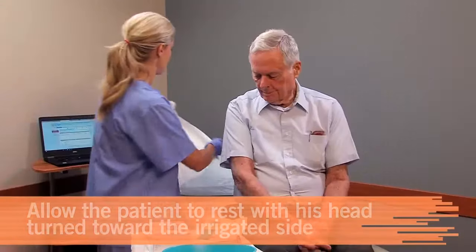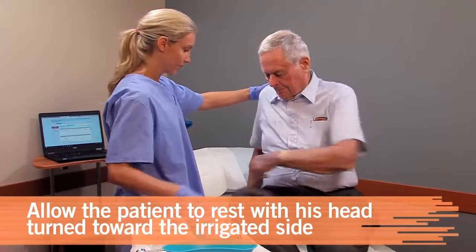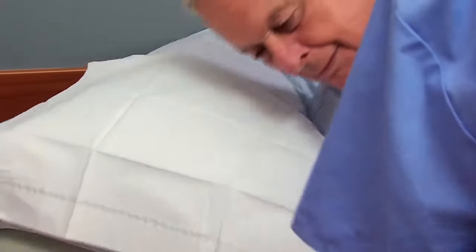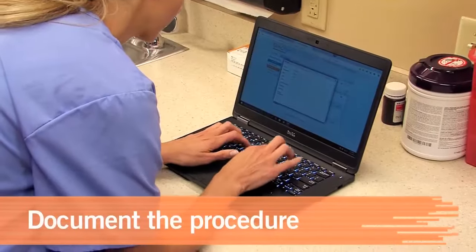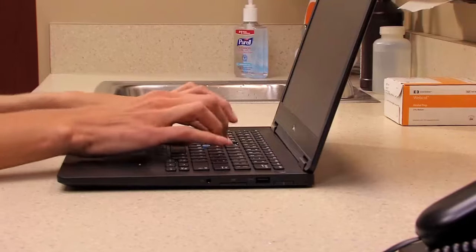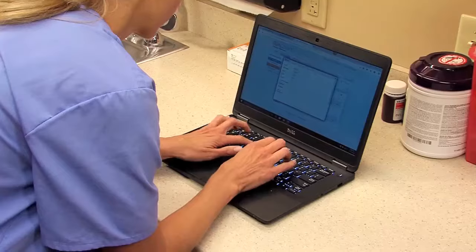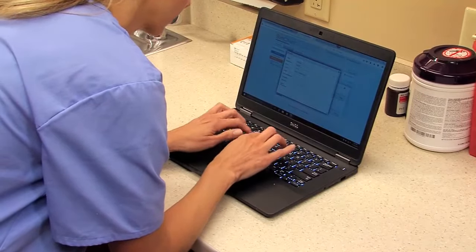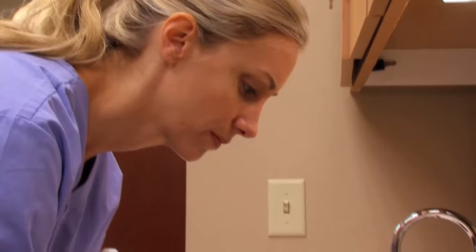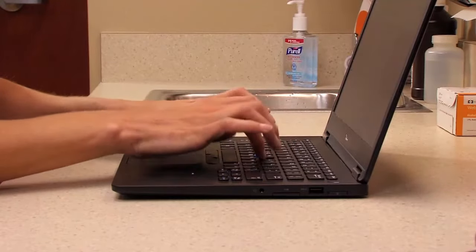Inspect the ear with an otoscope to determine the results. Allow the patient to rest quietly with his head turned to the irrigated side. Sanitize your hands and document the procedure in the patient's health record. Include the date and time, the ear irrigated, the type and amount of solution used, the characteristics of the material expelled, the visibility of the tympanic membrane after irrigation, and the patient's reaction, if any.